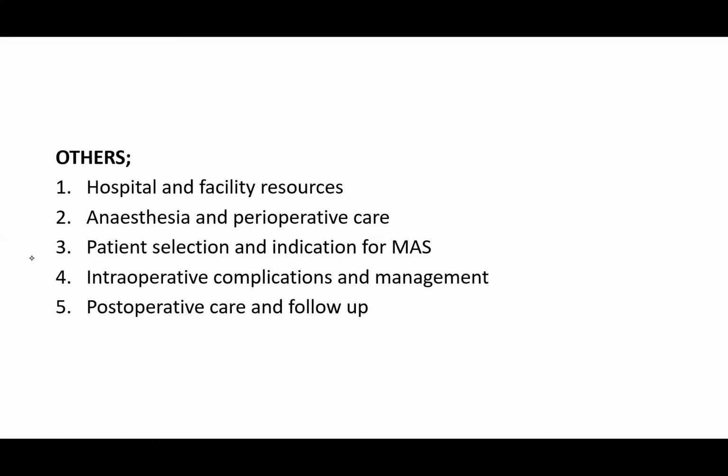Don't forget, patient selection is still applicable here, just as in open surgeries, because if you don't carefully select patients and those that are indicated, you can't just start doing.